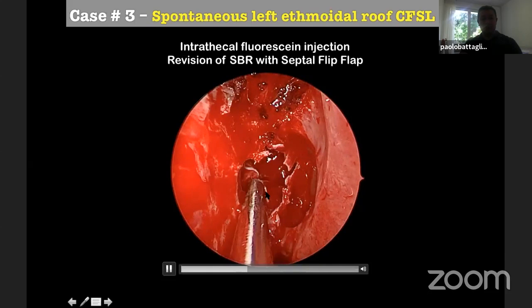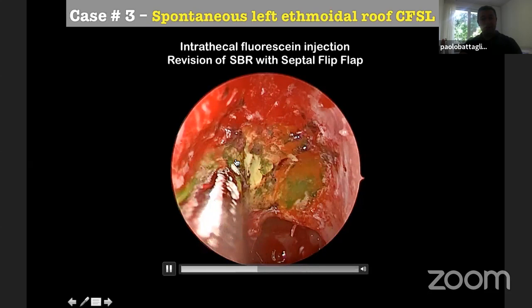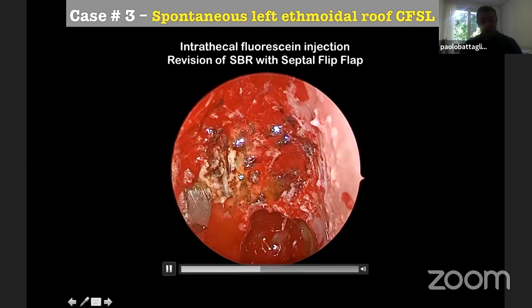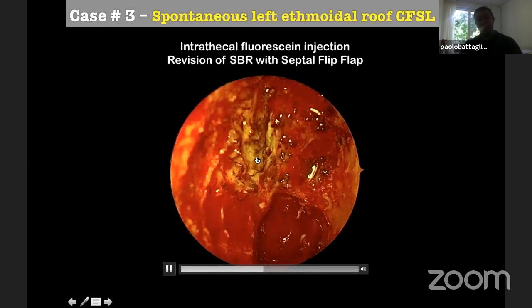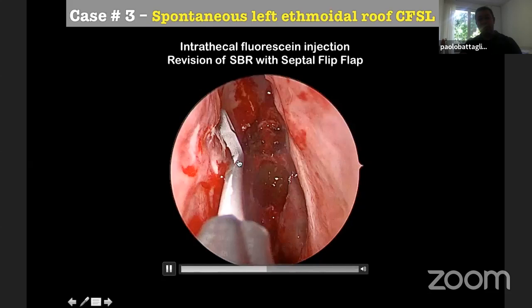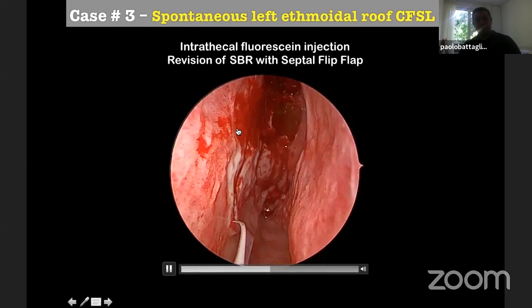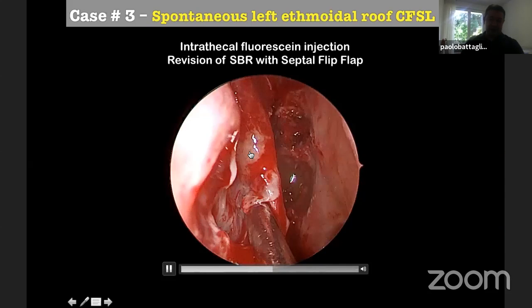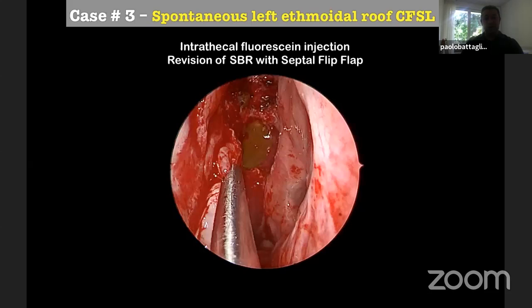And then smoothing again, removing all the septal. And here is the defect, at the level of the medial part of the ethmoid, of the olfactory cleft of the left side. So now we arrived at the origin of the meningocele, and so the idea was to remove here the bony part and the cartilaginous part of the septum, and to use the flip flap.